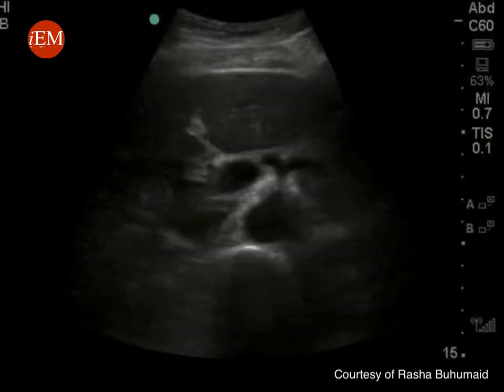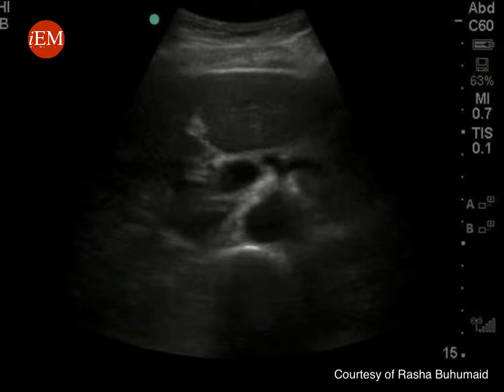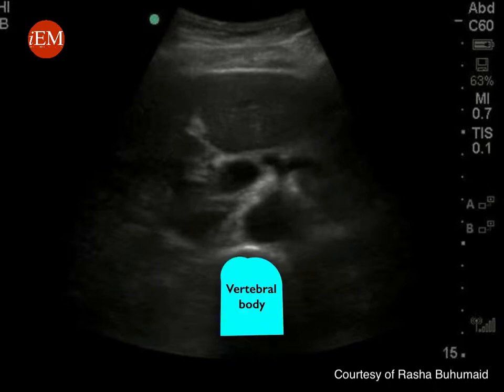This is the corresponding ultrasound image. The anatomical landmark to identify the abdominal aorta is the vertebral body, identified as a bright line with posterior shadowing. Just anterior and to the right side of the vertebral body you will identify the abdominal aorta, and just to its left will be the inferior vena cava.